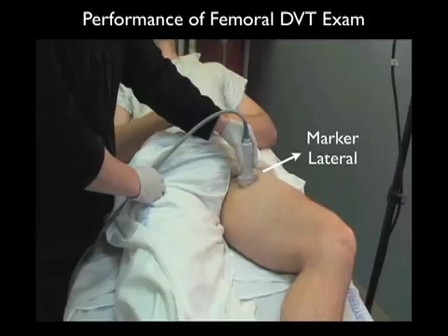It's best to position our patient slightly upright to distend the femoral vessels for the DVT exam, and as shown in this video, we actually had the patient with the head of the bed up about 30 degrees. We also want to have the legs slightly externally rotated to best orient so that we can place the probe directly over the common femoral artery and vein.